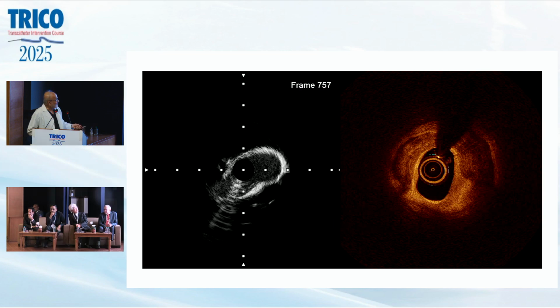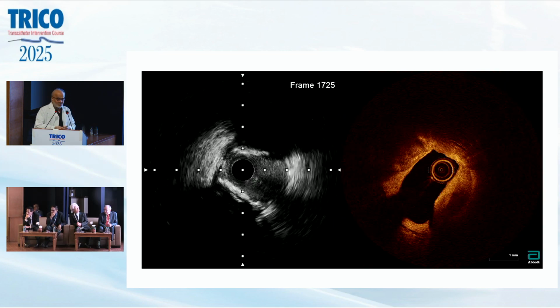And I was telling that these are great cases for IVL, because it's almost uniform and breakable calcium. Here in IVUS, somehow I am not convinced about calcium management using IVUS. I know that our Japanese friends are so fond of it, like Dr. Shigeru Saito, who loves using IVUS, and many of them. But understanding of calcium is what you have with OCT, you can't have it.